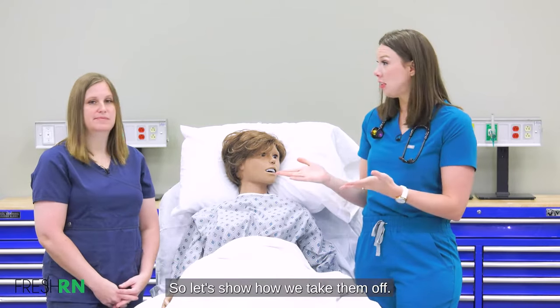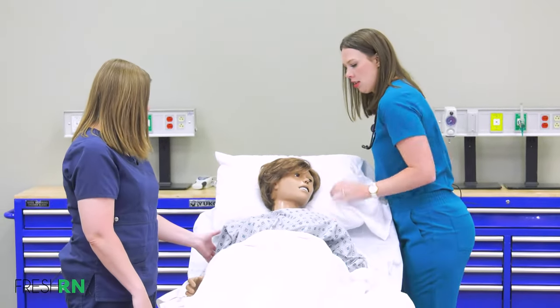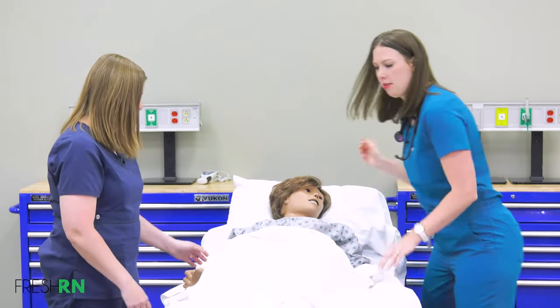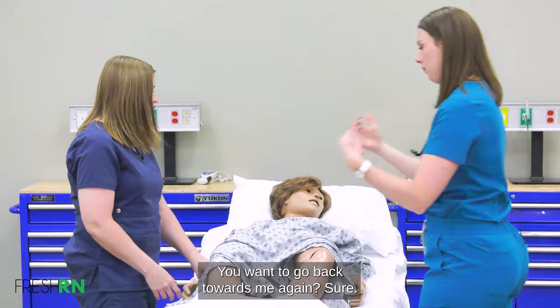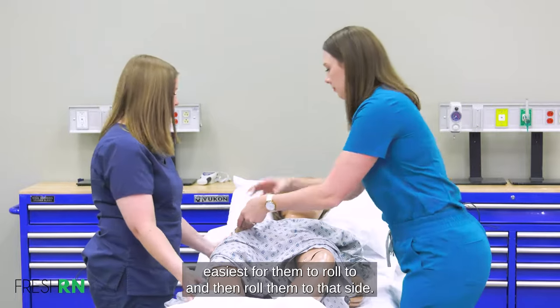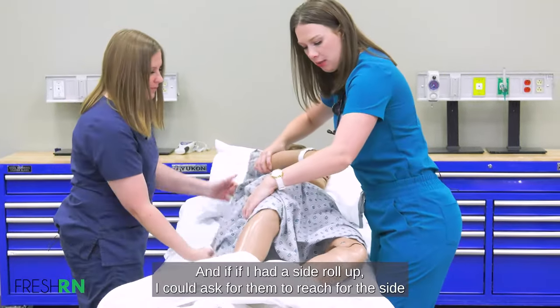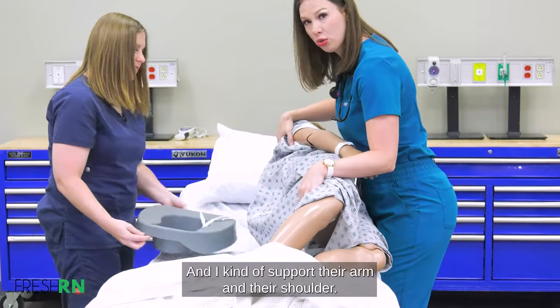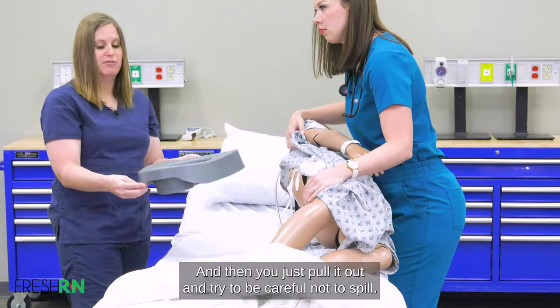So let's show how we take them off. Go ahead and put her back down — not fully flat, but enough. Do you want to roll back towards me again? You can always ask the patient which way is easiest for them to roll. Get their arm positioned, and if the side rail is up, ask them to reach for it. Support their arm and shoulder, then just pull the bedpan out and try to be careful not to spill.